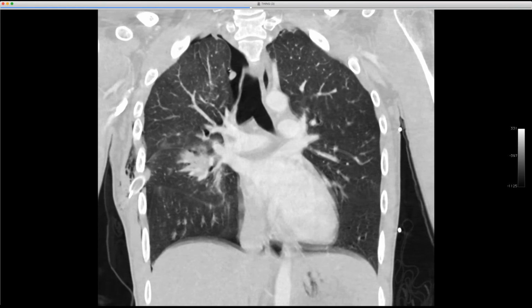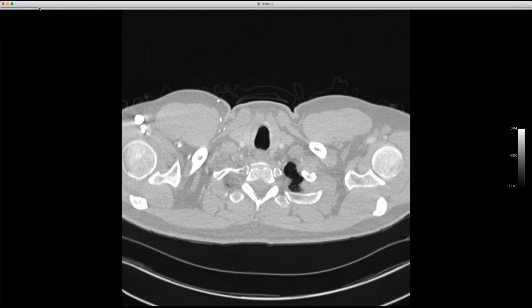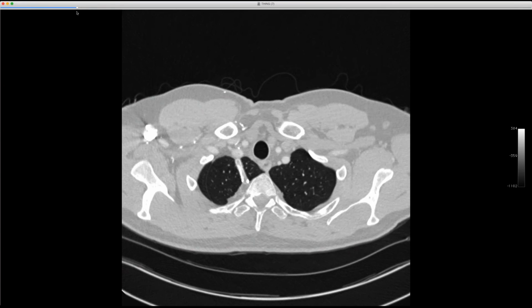Same. Right here, David. You can see sort of the little mesoazygous, as it's referred to in the literature. Right. Yeah. Cool. And then I found another one, and this one has your name on it, Howard. So I don't think this is the same case. Let's pull this one. Only I've seen it before.